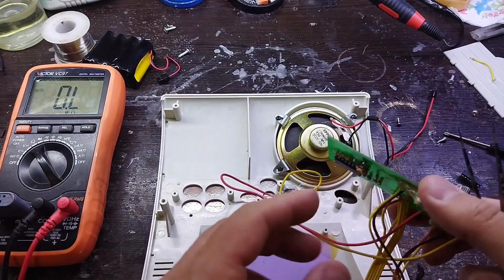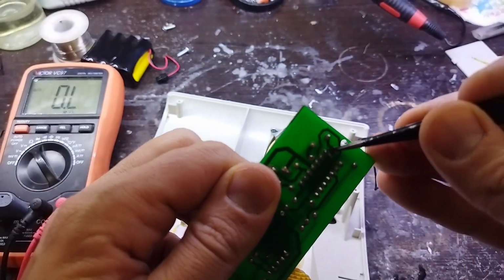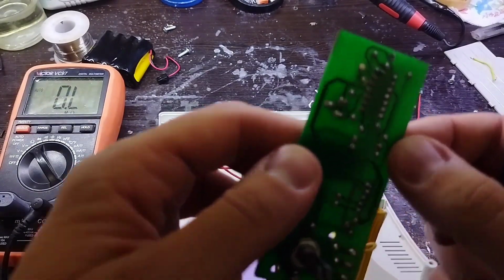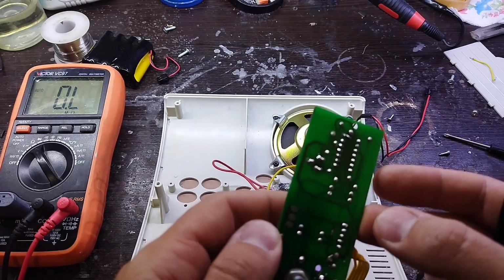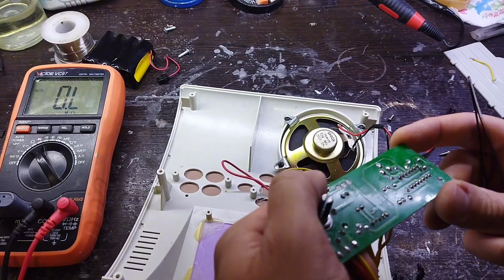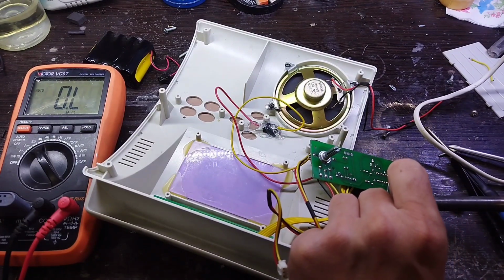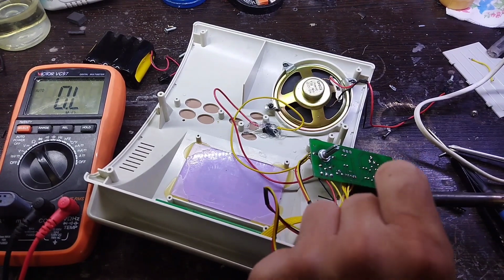Let's go back to repairing our device. This part of the PCB has the IC LM324N, and by replacing this IC, the problem of amplifying the sound of this device will be solved. This IC is one of the most useful ICs in electronics. The LM324 IC has 4 operational amplifiers, or op-amps for short, and in circuits and projects that require a large number of op-amps, using the LM324 IC makes the dimensions of the circuit smaller and prevents the circuit from getting complicated. In this device, the role of this IC is to amplify the sound of the fetal heart heard by the probe of the device.